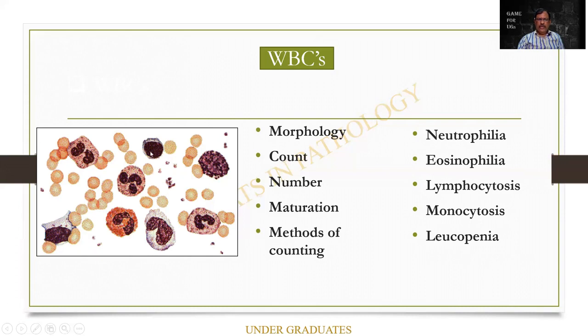Lymphocytes, the nucleus is almost similar to the size of the RBC. There can be a large lymphocyte that can be present. Still larger paler cell. In fact, this is the largest cell, a pale nucleus and a bluish gray cytoplasm, the monocyte. And there can be small granules which can be seen in the background. These are the platelets. They measure about 1 to 2 microns. You compare it with the RBC. And this is the clumping of the platelet. I hope you are able to make out all this.